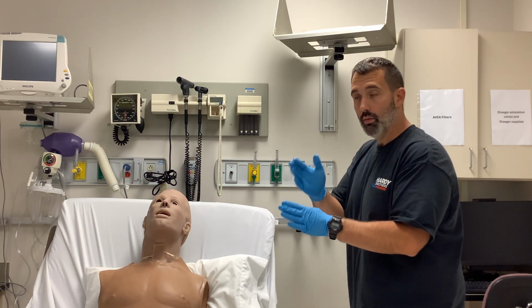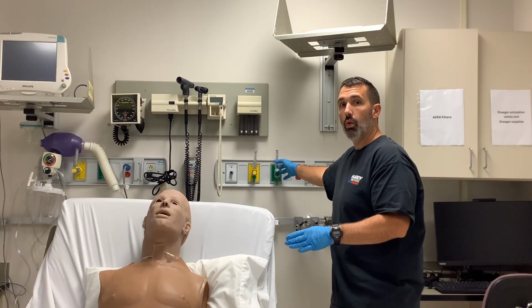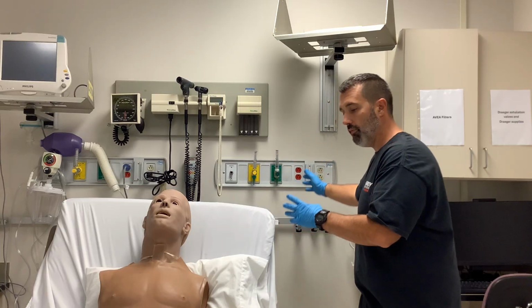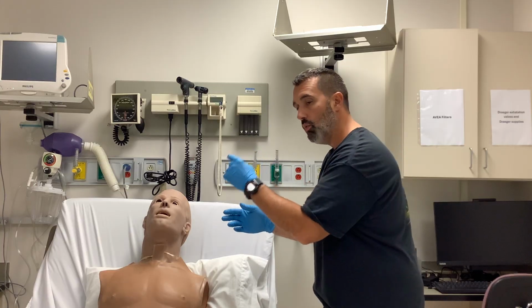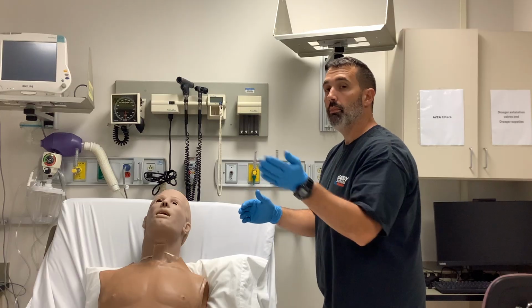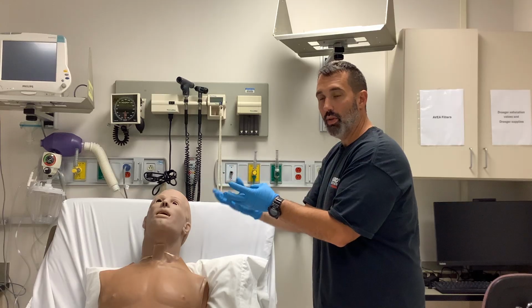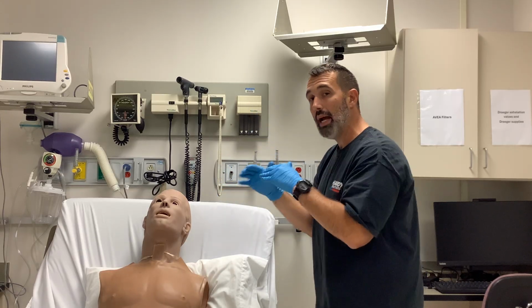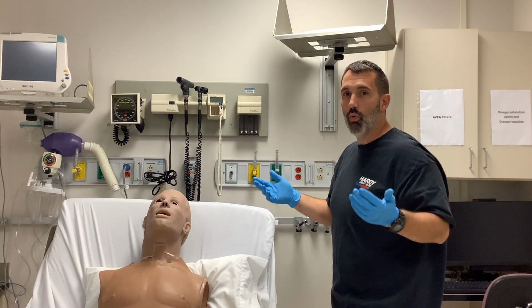the fraction of delivered oxygen through that nasal cannula, is 100% oxygen coming out of the wall. So 100% oxygen at 1 liter per minute coming out of the flow meter through the nasal cannula to the patient is 100% oxygen of 1 liter. Now this patient breathes in significantly more than 1 liter per minute. There's going to be 21% room air that mixes with that 100%, and it's going to knock the actual FiO2, the fraction of inspired oxygen, down to roughly, we estimate, 24%.